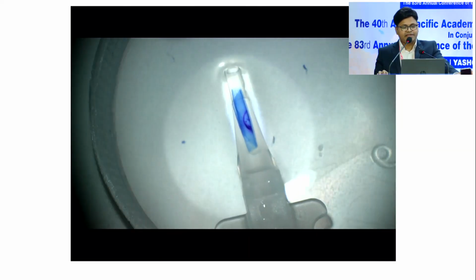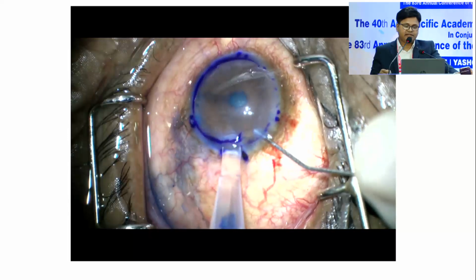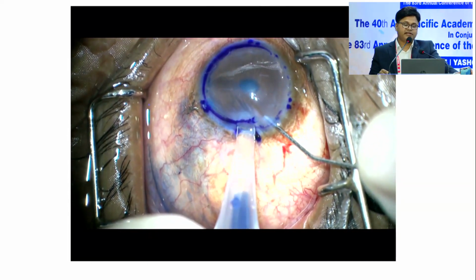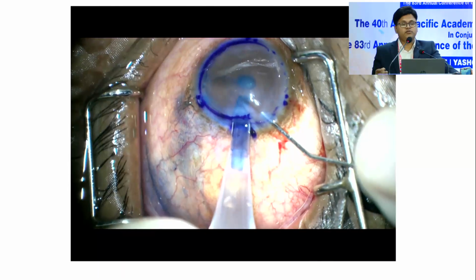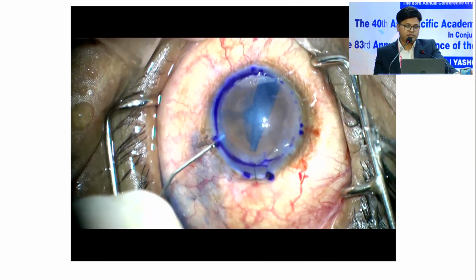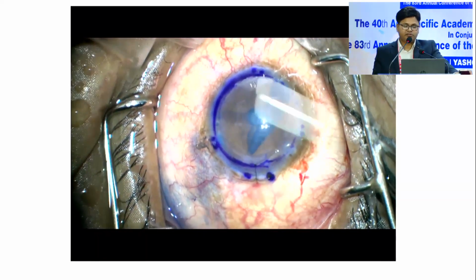And this is the Alcon D cartridge. There are several cartridges available in the market, but you can easily convert your Alcon D cartridge or any IOL cartridge simply by connecting it to the IV line and using that. And this is a 2.2 D cartridge, so I can inject my graft even with a 2.2 incision size, and I just need one suture. At times you can leave it sutureless also.